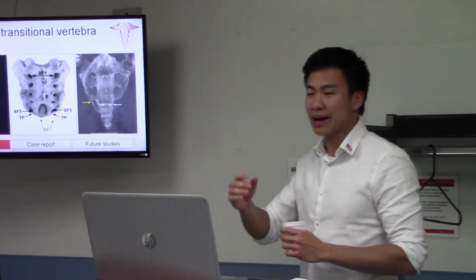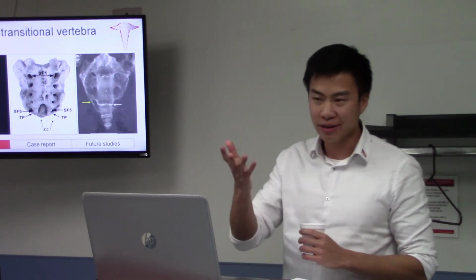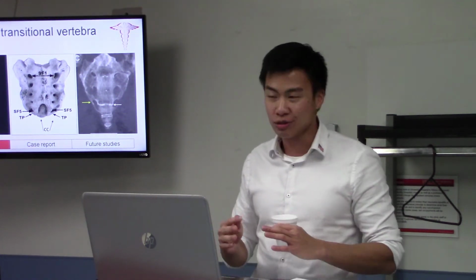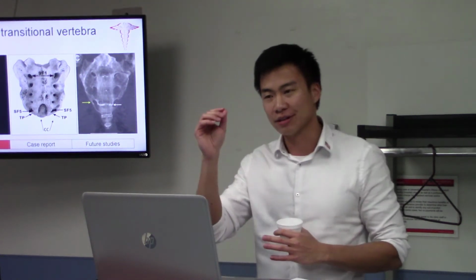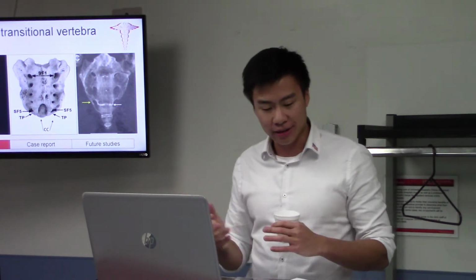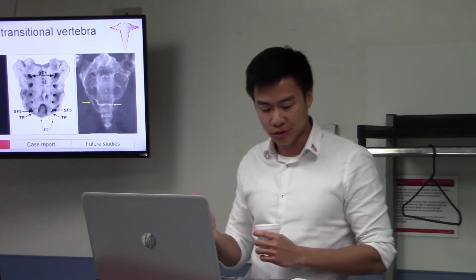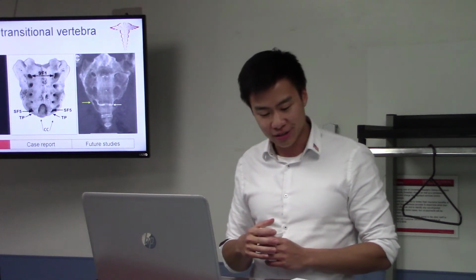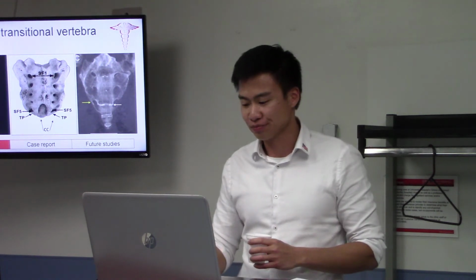But for the purpose of an injection, Dr. May doesn't really count the numbers of the coccyx. He just uses dynamic X-ray, and he'll find the mobile joint and inject in there. But I think in this clinic, you guys make a point to include the exact joint. I think this is nice for the patient, as it gives a more accurate diagnosis.